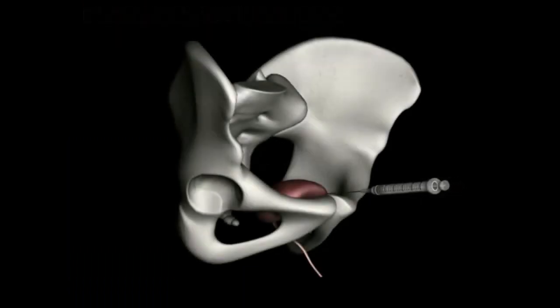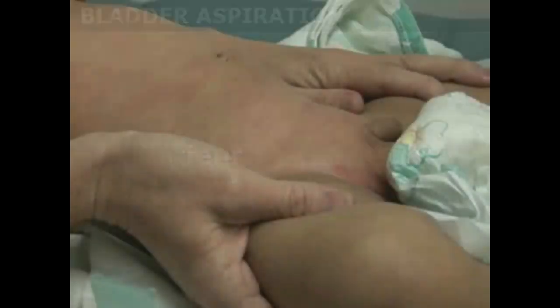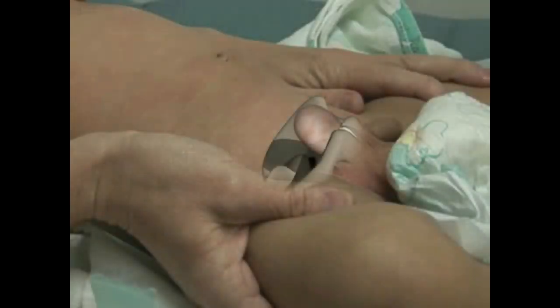The suprapubic tap provides an excellent option for obtaining a sterile urine sample where catheterization is not successful. Secure the infant in a frog-like position to allow easy access to the suprapubic area.